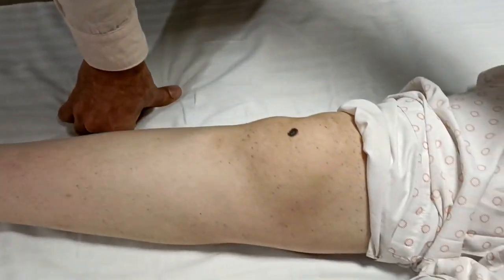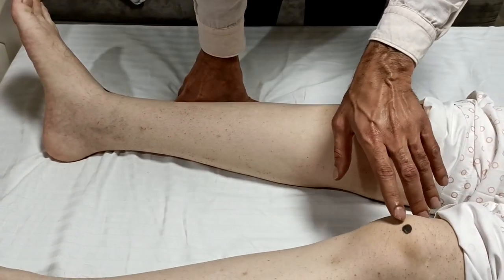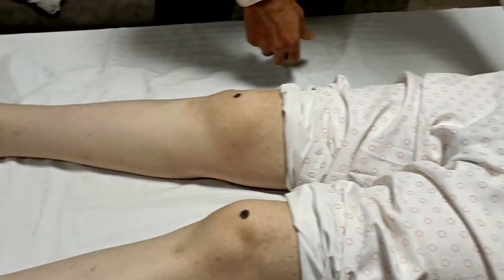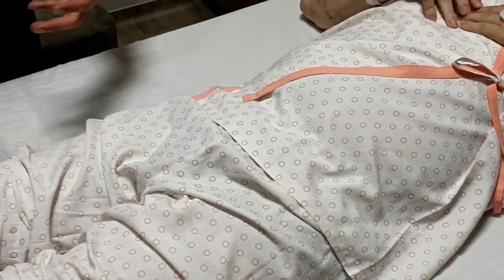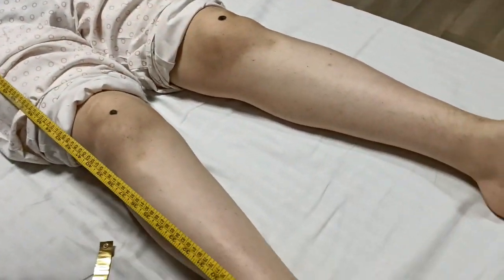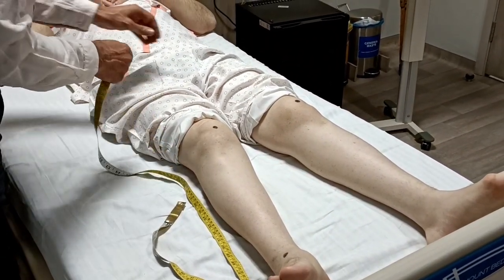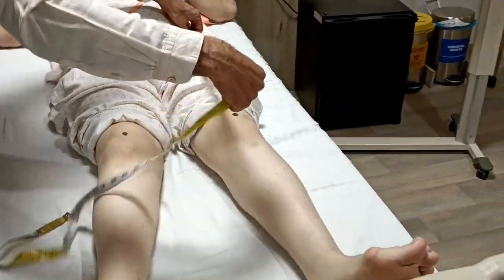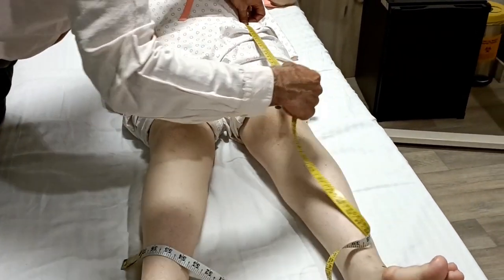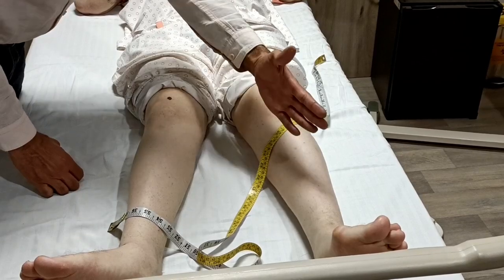Now if you look at the knees, there is a valgus deformity — the tibia is going out and it is more prominent on this side. We have marked the center of the knee, center of the ankle, center of the knee, center of the ankle, and this is our hip joint. So now we will see how much is the valgus angle. If I connect the hip joint to the center of the ankle, this is a straight line. So the knee should be in the same line. If I connect on this side and connect the center of the ankle, the knee is on the medial side, on the inner side — actually it should be crossing the knee like this in a normal person. That means there is a valgus deformity, that means there is a knock knee deformity.